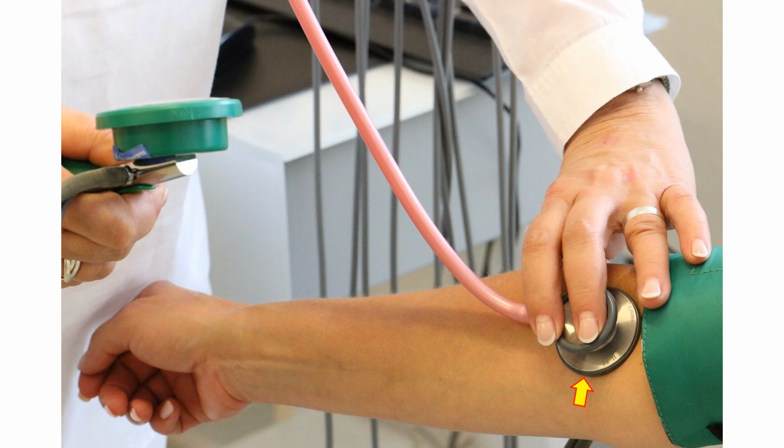Then the cuff is deflated slowly, listening to sounds over the elbow. The sounds are heard when the cuff pressure falls below the systolic pressure and disappear when the pressure is below the diastolic pressure. Both these levels are noted.